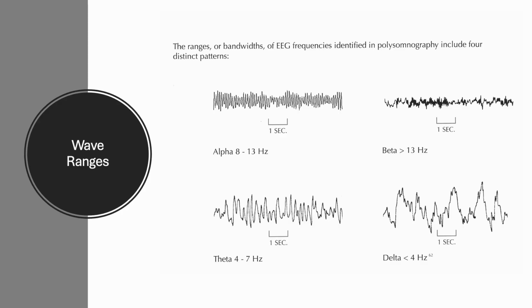Here's a special studying note. Whenever you see figures like this, draw them in your notes. Things like basic waveforms, or later on when we talk about obstructive and central apneas, draw what the effort belts and the airflow would look like. If you can draw it, that means you can see it in your head. And if you have it in your head, then you know the material.